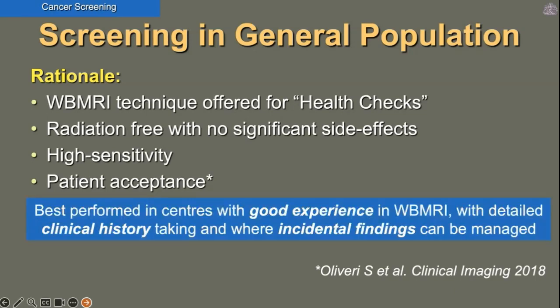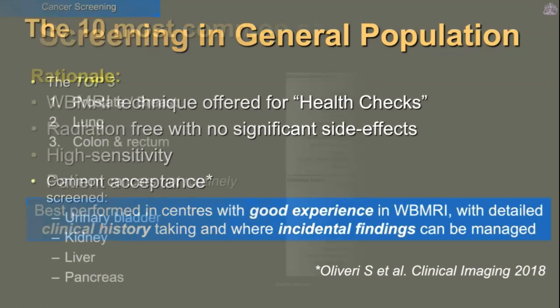However, we advocate, and Anwar and I are very passionate about it, that if we want to undertake this, it should be performed in centers with good experience in whole body MRI, which Anwar and myself can provide. But we really need good clinicians to be co-partners in this screening program, because we require a detailed clinical history to be taken. And most importantly, we need incidental findings, which are very, very common in this group of patients, to be appropriately managed.